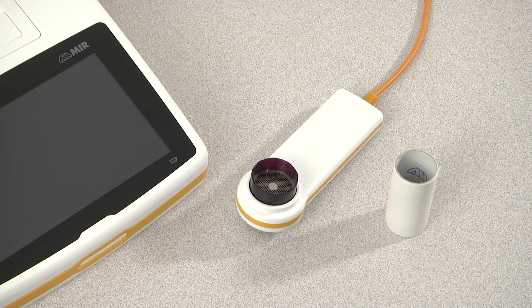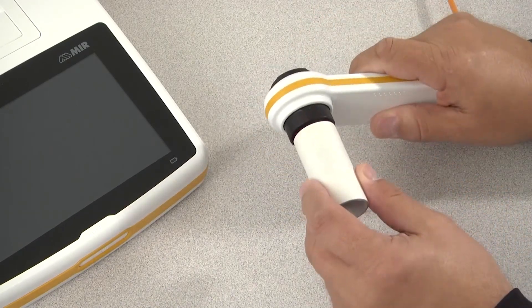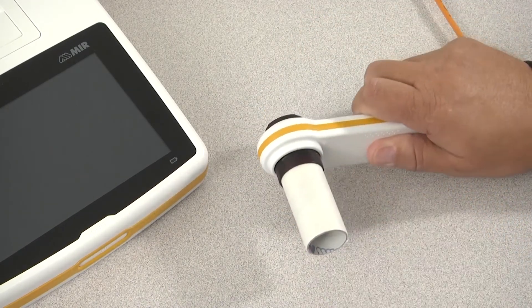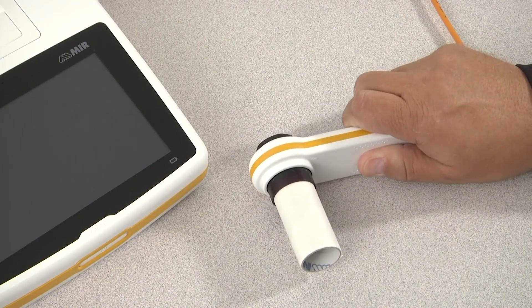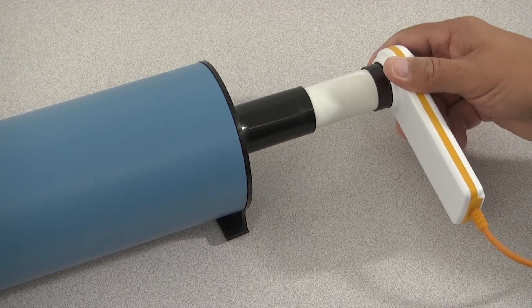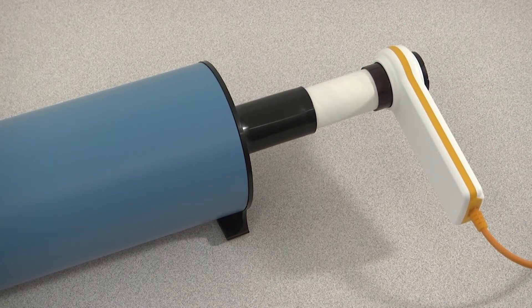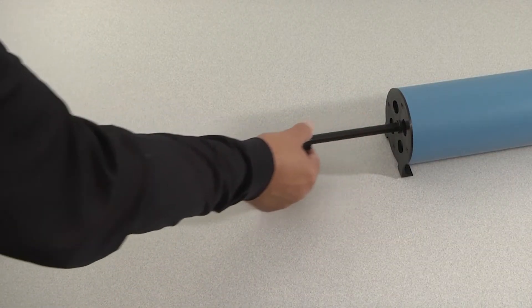To begin the calibration check, insert a cardboard mouthpiece into the Flomir. If you are using the Flomir disposable turbine, insert it into the flow meter. Connect the flow meter to the 3-liter calibration syringe, making sure you have a tight seal so there are no air leaks, and pull the syringe plunger all the way out.